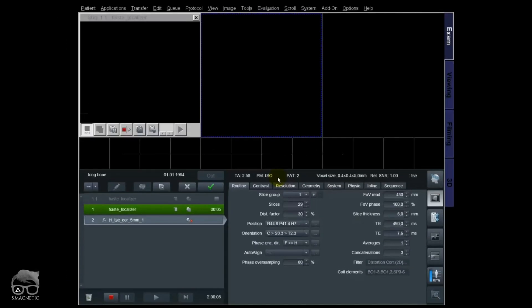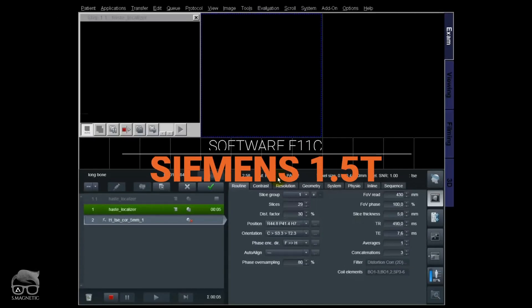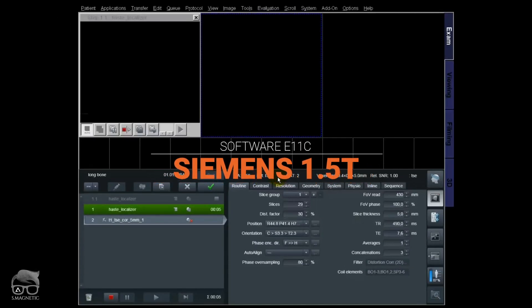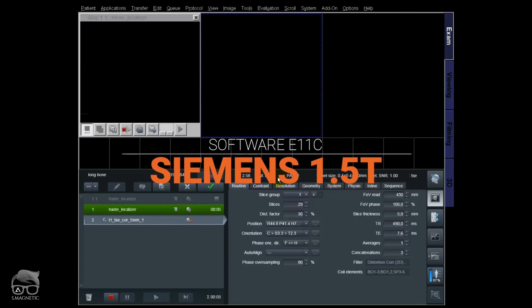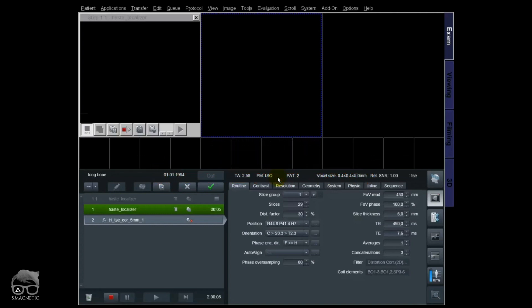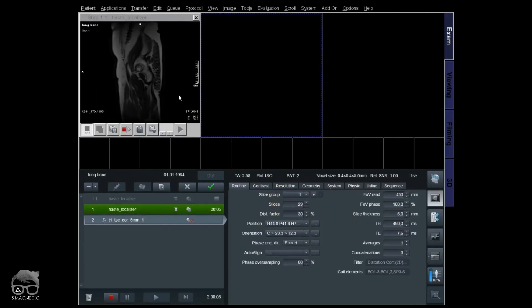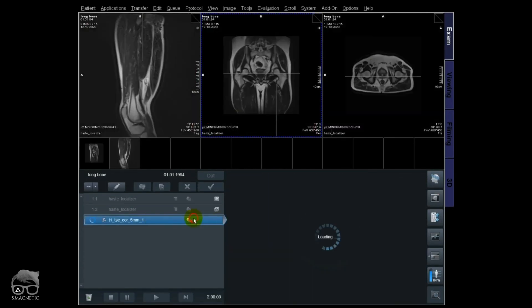We are at a 1.5T scanner, but the things I'm going to show you will also be available on 3T as long as you have the options I'm going to show you soon. I'm going to do some long bone imaging here.